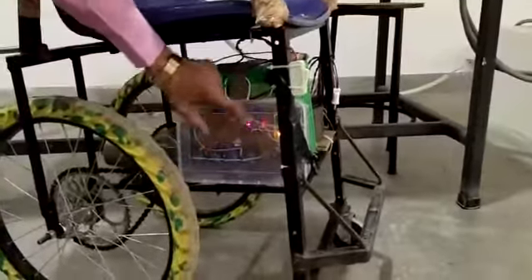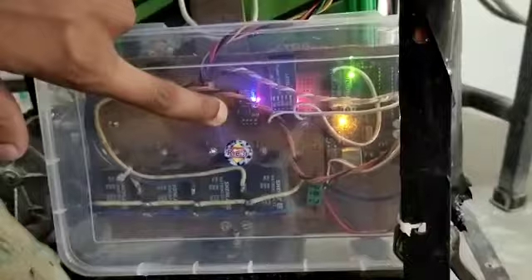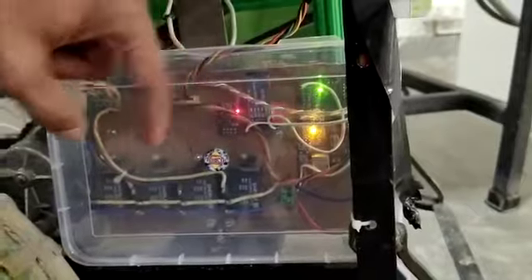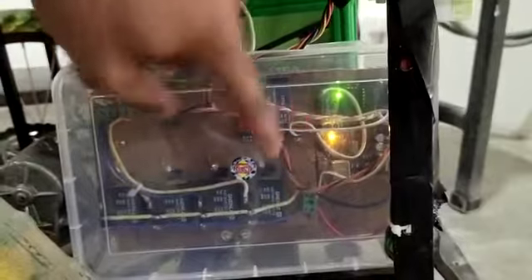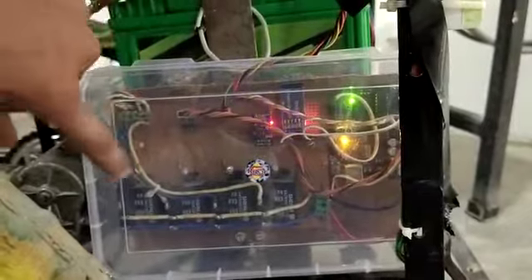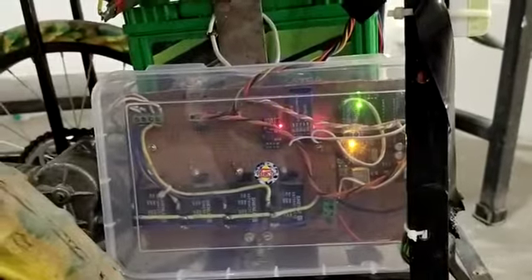This is a power switch, and in this box this is Arduino. Here is the Bluetooth, and Wi-Fi. Four SPDT relays are used to make a motor driver circuit in the shape of an H-bridge. Transistor, LED, resistor, and diode are also used — IN4007.